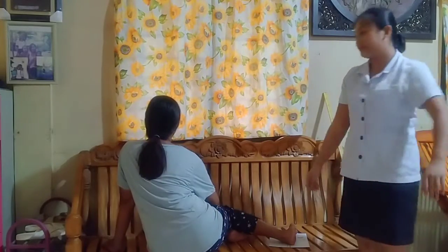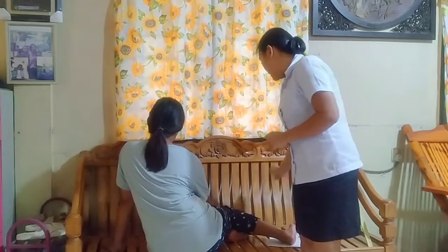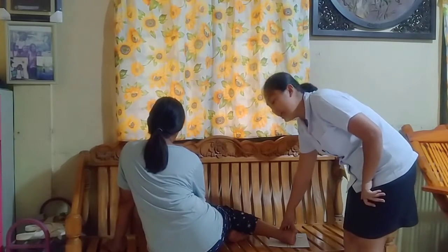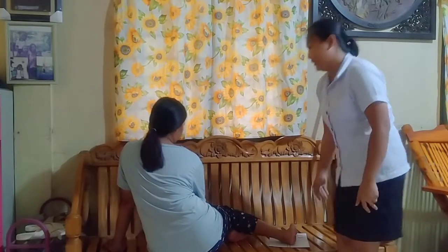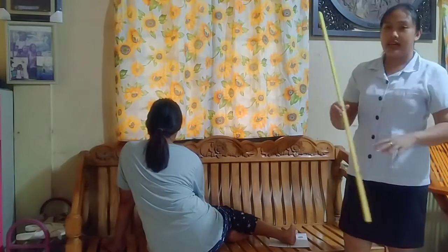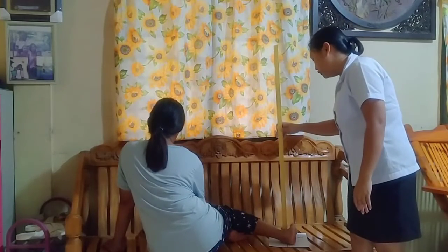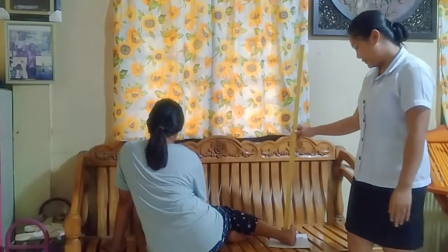Now, rotate the patient towards the unaffected side, placing the medial side of the foot in contact to the IR. And still, the central ray is perpendicularly directed to the base of the third metatarsal.